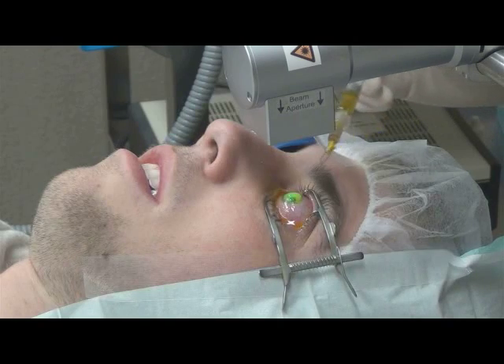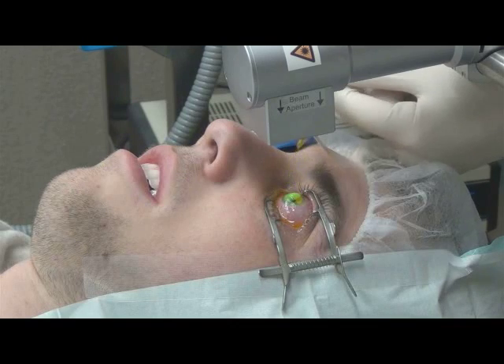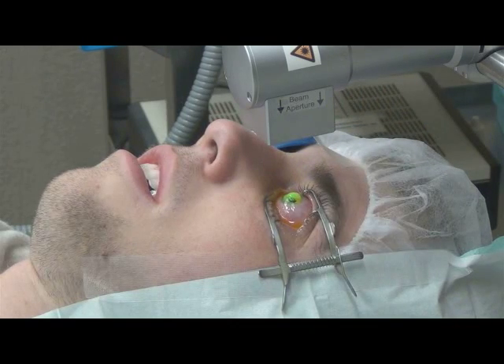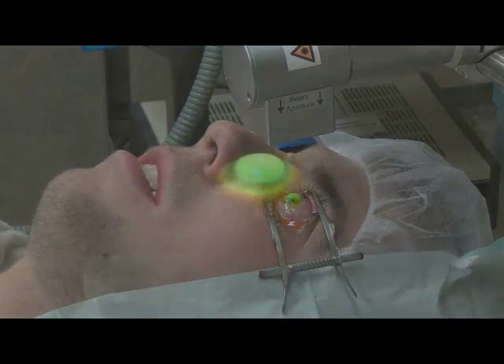We line it up perfectly and the patient needs to just look directly at the light. During the course of the treatment, we may be applying other doses of the riboflavin depending on how long the actual treatment is. This has been a very exciting treatment that actually stiffens the cornea and makes it so that the weakening condition, or in some cases ulcerative problems, stop and in many cases reverse.